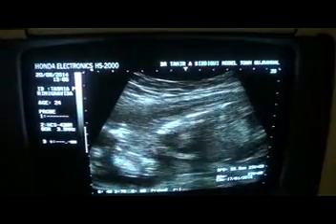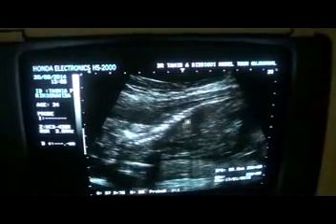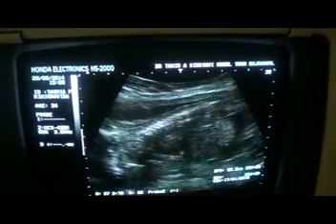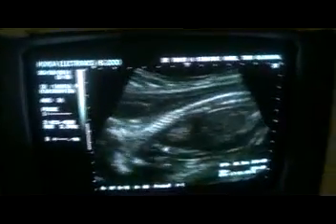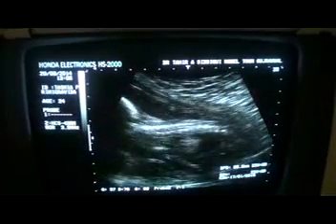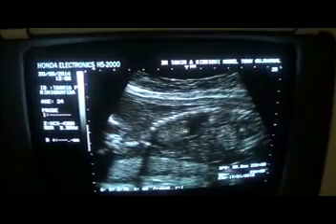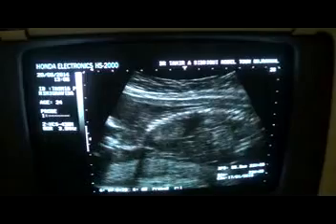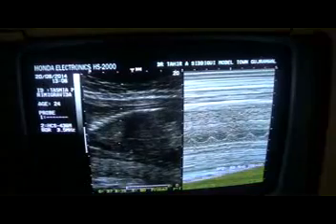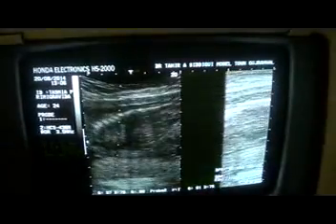As you can see, this is the fetal lung. This is the lung tissue, and here you see cardiac flicker, and in between you see this is the fluid. This is a better view. The cardiac activity is seen, and here you can see a better view of the pleural space with the lung, and this is the lung tissue, this is the fluid in the pleural space, this is the heart, and the cardiac activity is between 136 to 140 beats per minute with regular waveform.